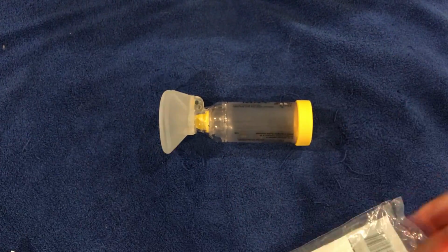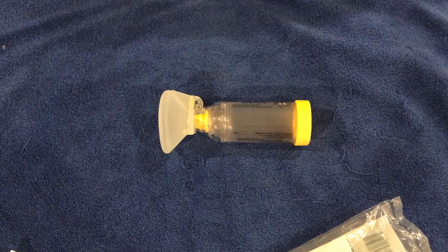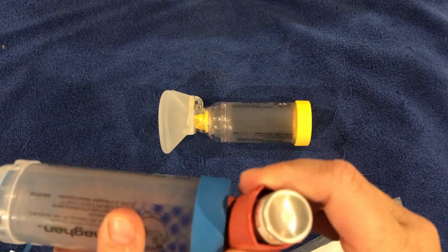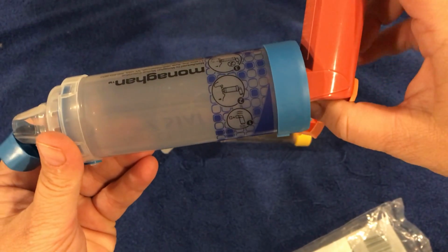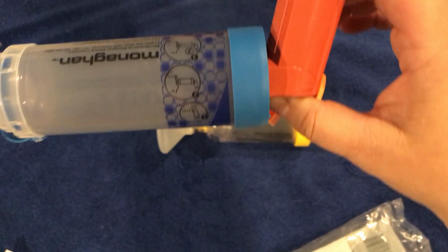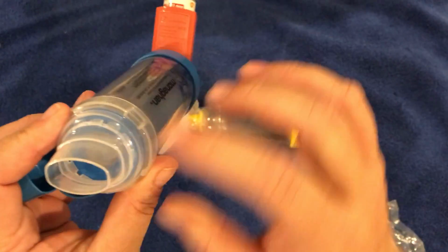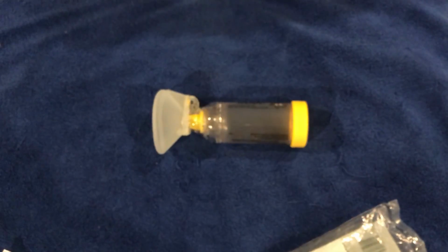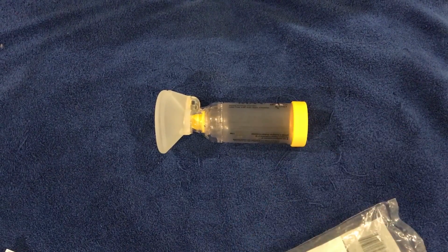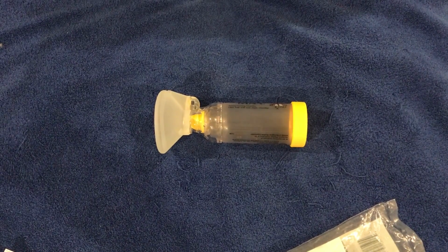And I'm gonna switch this one for this one. Oh, you have to shake a lot. This one you shake. And then ask the patient to exhale. And after he exhales, you put the medication here on the chamber. You see now it became quite white. Then you ask him to seal his mouth around here, and he makes a noise. When the noise is gone, it means there's no medication left in the chamber.